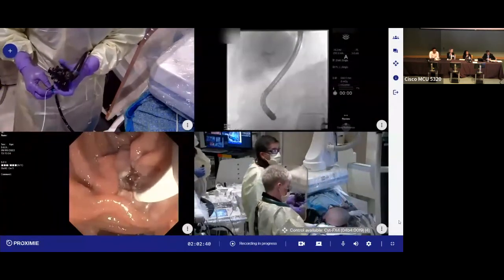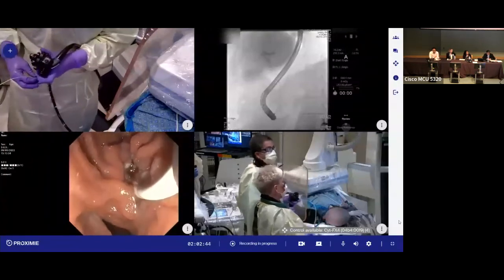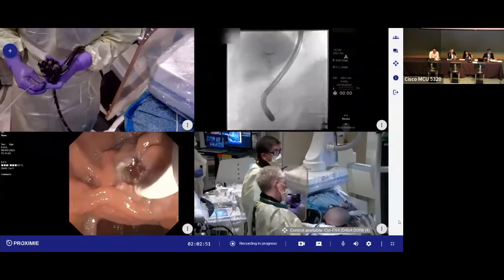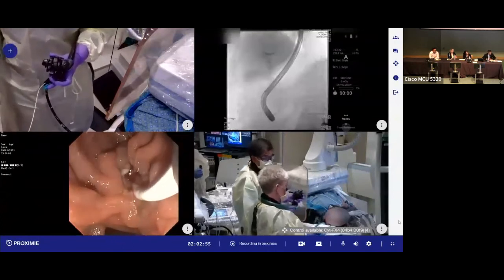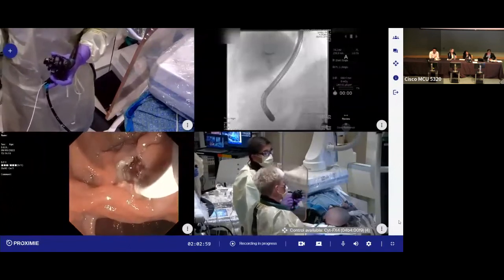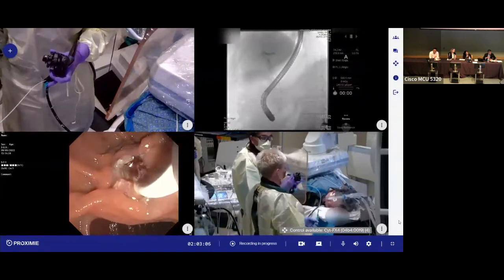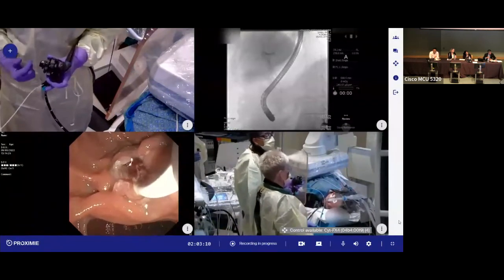Going to go to 9 here. So I'm at 9 millimeter. I did hear the question, Sachin. I'm going to answer that. I just want to make a point that the 9 millimeter balloon is what's inflated now. And when Carrie did the 9 millimeter balloon, I don't know if you saw her hands on that, did you go all the way up to 12? She goes all the way up to 12 and then back to 9. But sometimes we have a technique, if the duct isn't too dilated, we'll do what's called a gentle 9, where it's just a little bit of air in without going all the way to 12. I especially do that in the pancreatic duct.